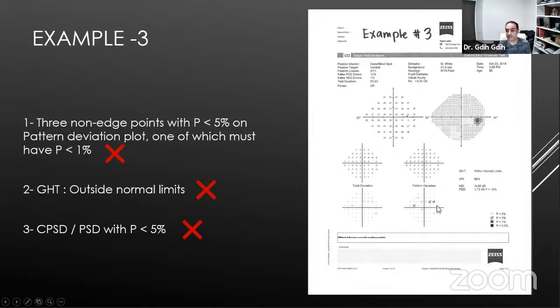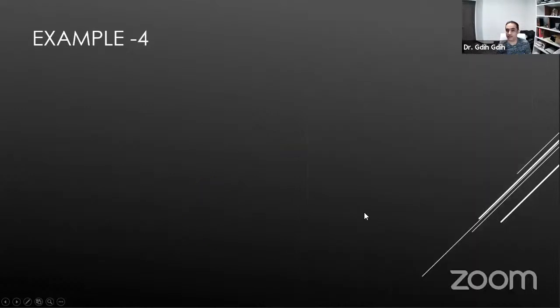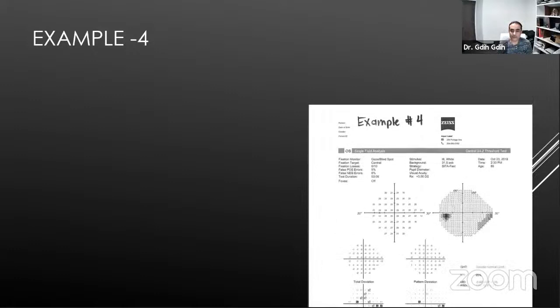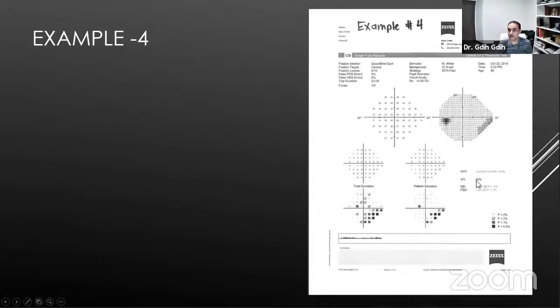So even if someone comes to you and says, oh, could be glaucoma, say no, it's not glaucoma. Again, I'm saying visual field language, not clinically. As I said, clinically, you could have someone with a totally normal visual field, but they have glaucoma. Okay, now let's move on.